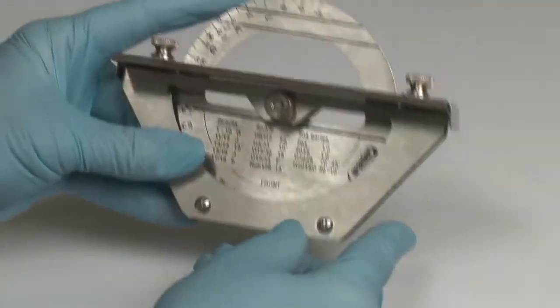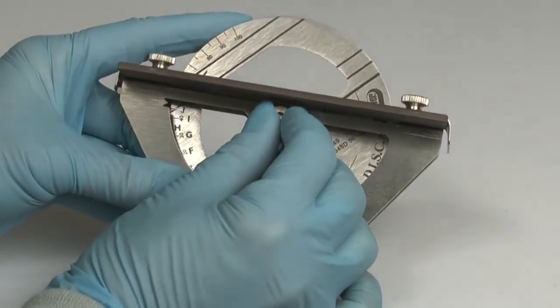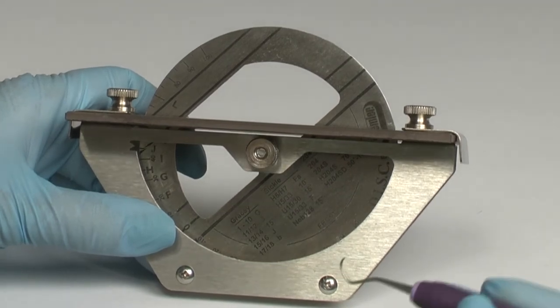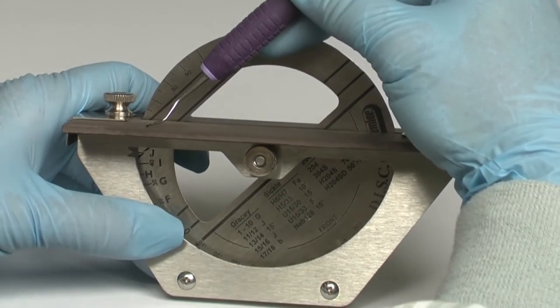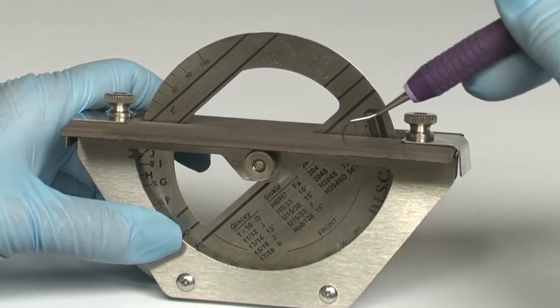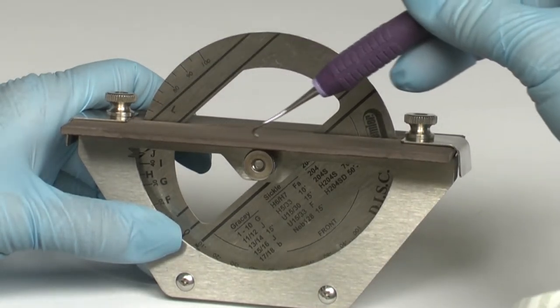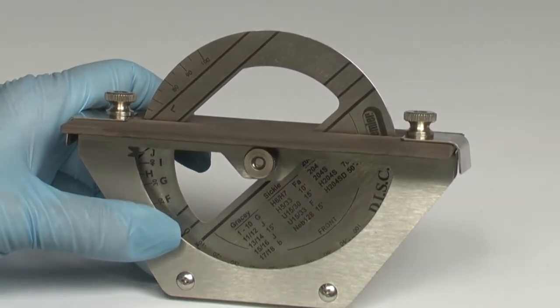Rotate the wheel so that the upper case J setting lines up with the indicator line. Tighten the screw. Start with the number 14 working end and place the cutting edge on the front stone with the toe facing the wheel. The handle of the instrument is aligned parallel to the bold reference lines on the wheel. Then simply move the instrument blade across the stone while keeping your wrist steady so the instrument remains aligned with the bold reference lines during the entire stroke. The final step requires the operator to roll the handle in a gentle grasp so that the curette is finished in a smooth rounding of the toe.